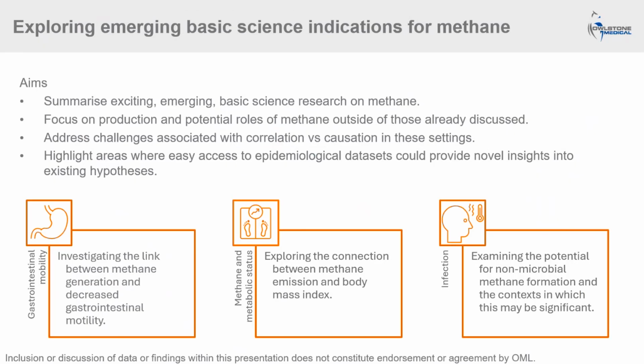So it's not going to be quite as accurate or quite as precise as a lab-based hydrogen methane breath test, but it is going to give you the ability to collect very data-dense longitudinal information, helping you understand those hydrogen and methane dynamics. So a little bit of a different use case for this device, we think, versus the kind of clinical setup that a lot of people use. What I'm going to do now is just pass over to Matt. We've talked a little bit about OMED device and digestive health and given you some ideas there. There's potentially indications that hydrogen and methane might be useful in other places as well. So Matt's just going to talk to you a little bit about that and give you some potentially more ideas in terms of where hydrogen and methane could also be analysed in different research areas.